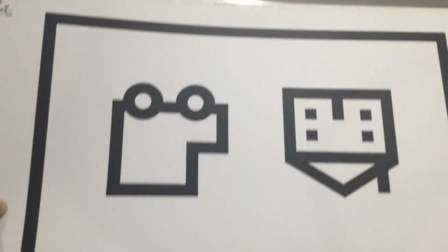But let's just imagine for a moment that the child only gets one symbol. So on the page that's facing me, remember the truck and the house, I know they're going to be upside down, are on the opposite side. We have this box in the corner. I hope you can see that. Now it's the same on every page. Now remember, there were only 2 pictures on the opposite side. The house and the truck, there they are, they're still there.